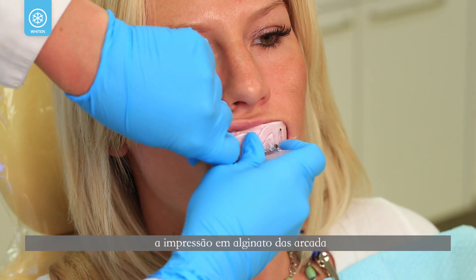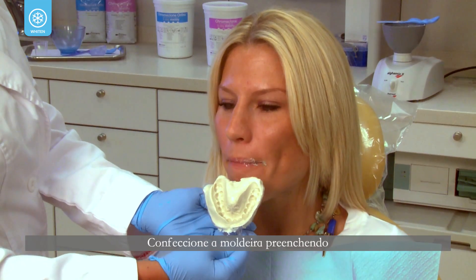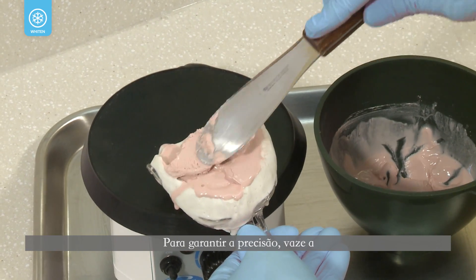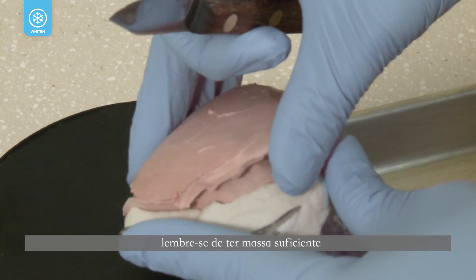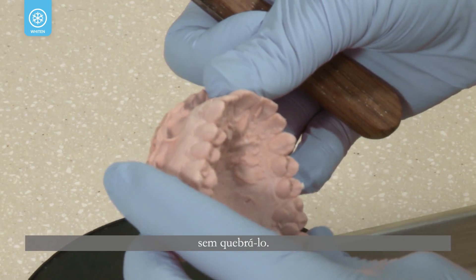The first step is to take an alginate impression of the patient's upper and lower arches. Fabricate the tray by pouring the alginate impression with fast-set plaster or dental stone. To ensure accuracy, pour the impression shortly after taking it. When fabricating the tray, remember to have enough mass to remove the model from the impression without breaking it.